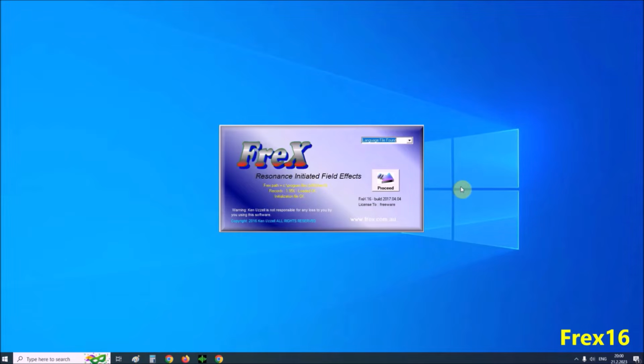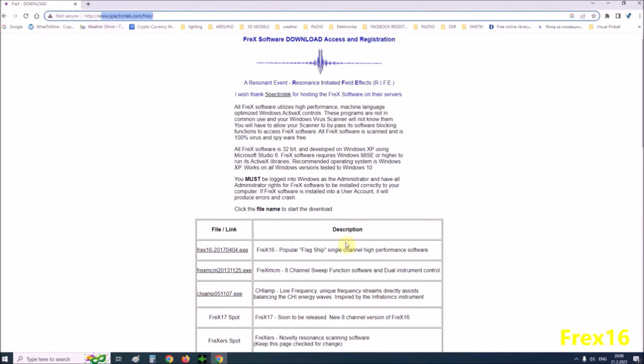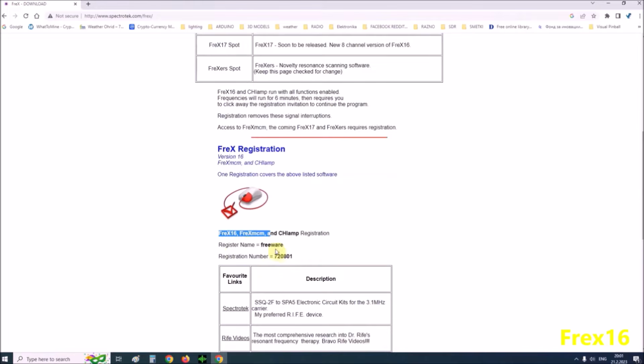Frex16 is a wonderful free program created by Ken Uzel. You can download it from the Spectrotech site, where a registration number is provided for free use. Now I will briefly describe how to use it.